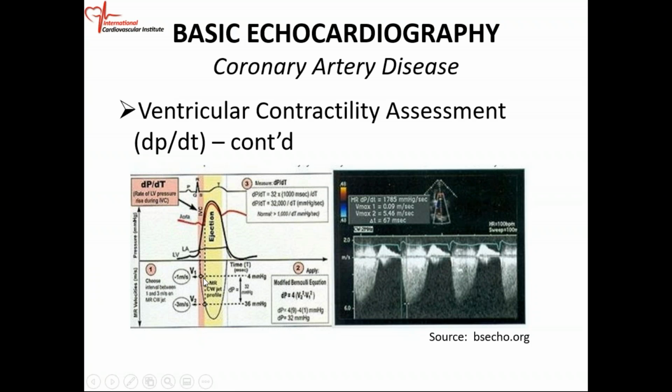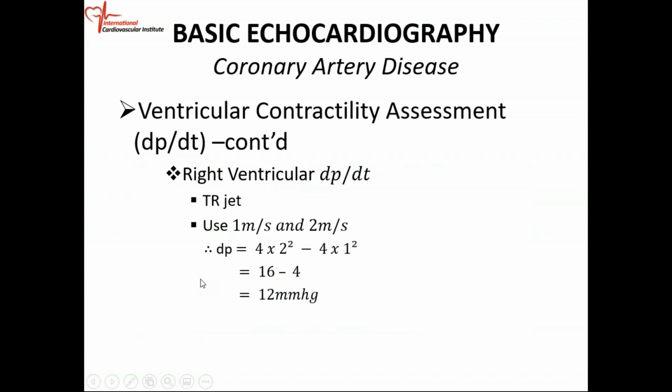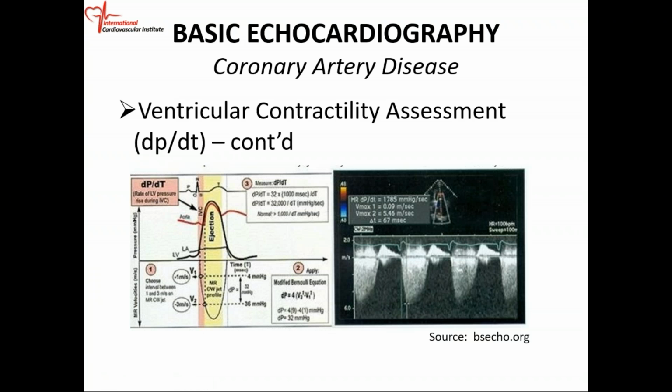So remember the definition: you're going to see the change in pressure with respect to time. When we talk about velocities, we can convert velocity into pressure gradients, so essentially that's what you're doing. At 1 meter per second, there's a pressure gradient associated with that, and at 3 meters per second, there's a pressure gradient associated with that.